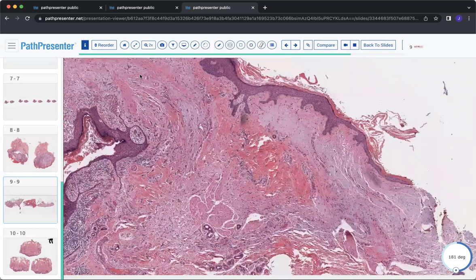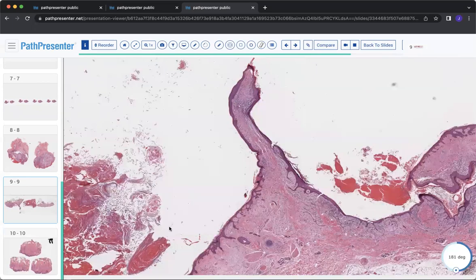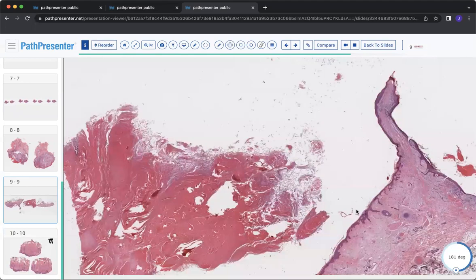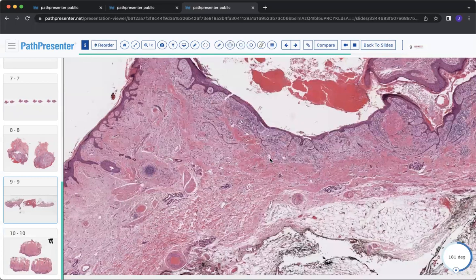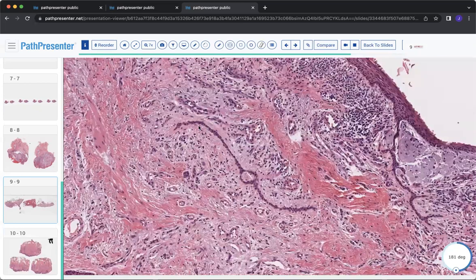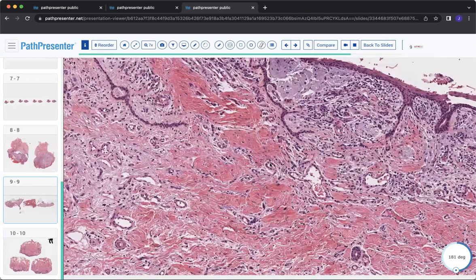So clinically, these may present as small papules on the face of somebody with a syndrome. And the classic syndrome that you should know is Birt-Hogg-Dubé. And so if the question that you were being asked seems that they are looking for some type of adnexal tumor and you're not seeing a lot of things going on higher power, you'll start to notice these strands of keratinocytes that seem like they're trying to organize into something. But in this case, you have mostly collagen.